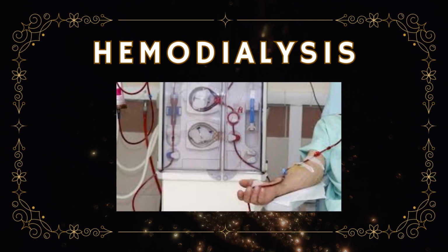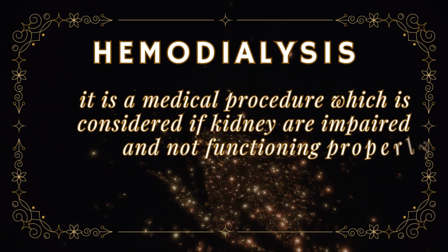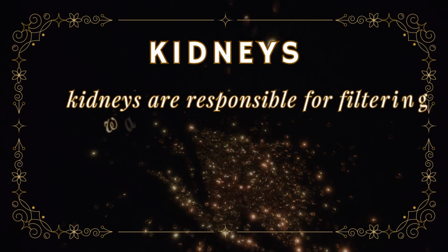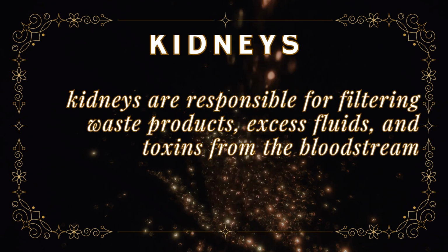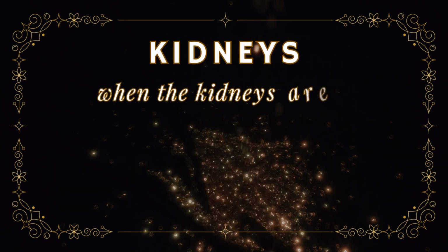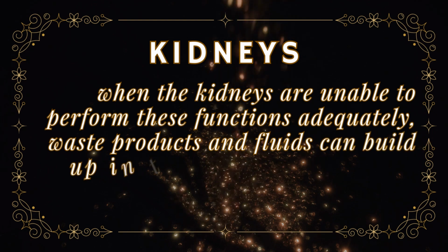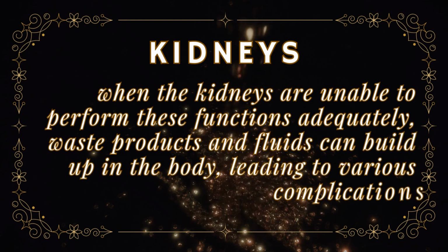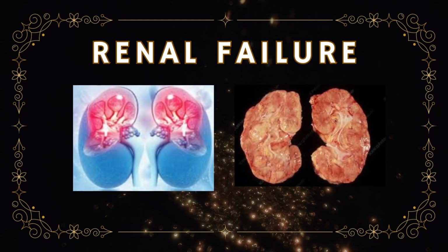So let's discuss a medical procedure called hemodialysis. It is a procedure which is considered if the kidneys are impaired and not functioning properly. Kidneys are basically responsible for filtering waste products, excess fluids and toxins from the body. When kidneys are not functioning properly, called renal failure, waste products and fluids can build up in the body, leading to complications. To avoid these complications, dialysis is done.